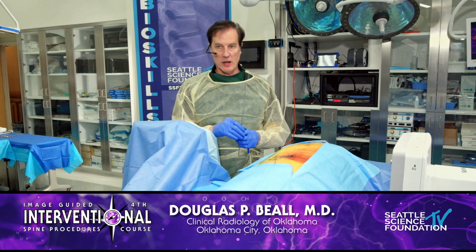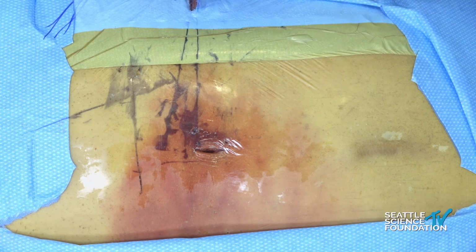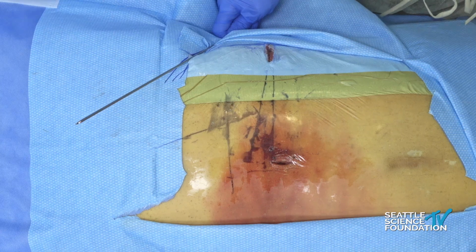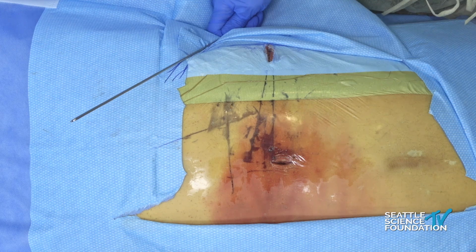And so we're going to start out with a lateral approach. This is the demonstration of the angle of the sacrum. So I'm going to put this right here, and let's take a picture of that. Okay, picture again. Good. That's the angle of the sacrum.